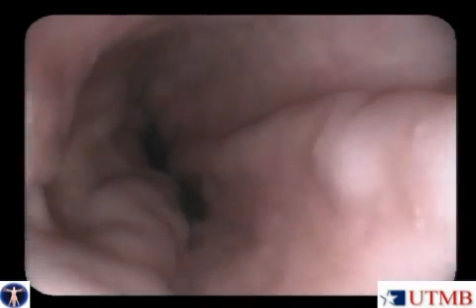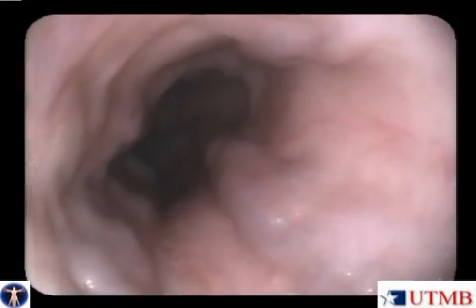However, on further withdrawal of the endoscope, esophageal varices come into view in the mid to upper esophagus. This is the classic location and appearance of so-called downhill esophageal varices. These varices are grade 2, protruding into the lumen but not obstructing it, and with no signs of hemorrhage.